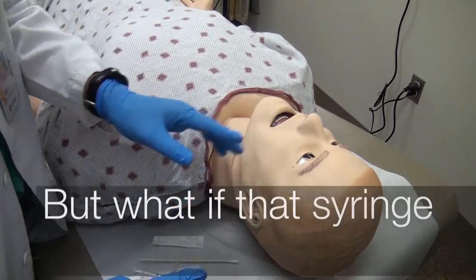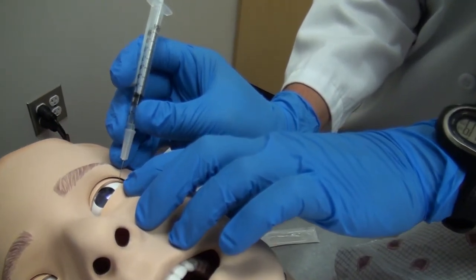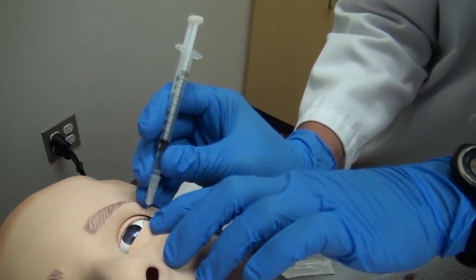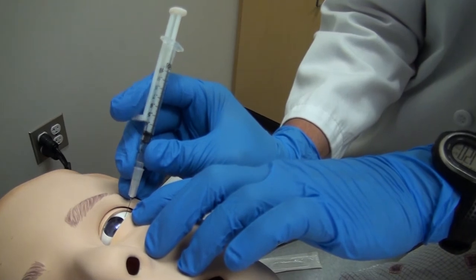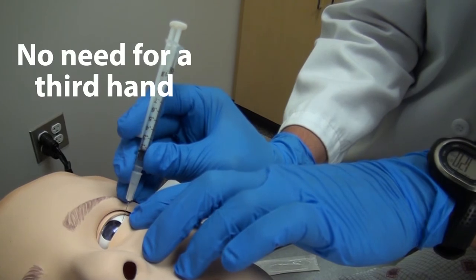Hold the draw. Looks like I can just kind of keep my index finger to the side, kind of get in my same position. Minimize that movement. Keep control of my needle — a needle inside the eye.